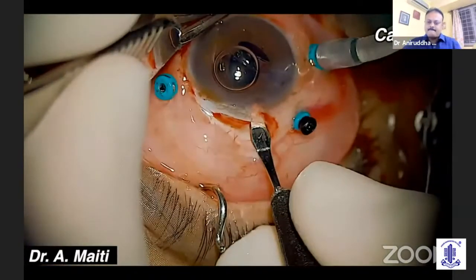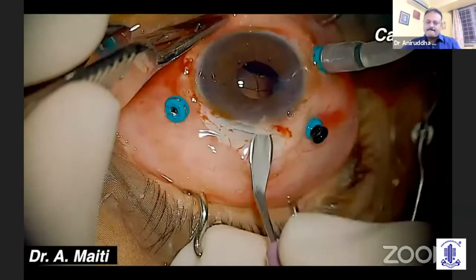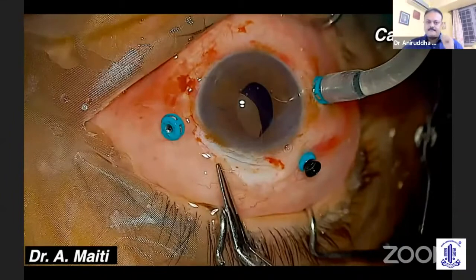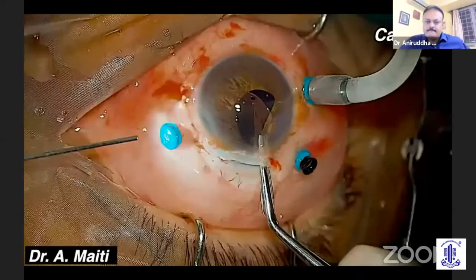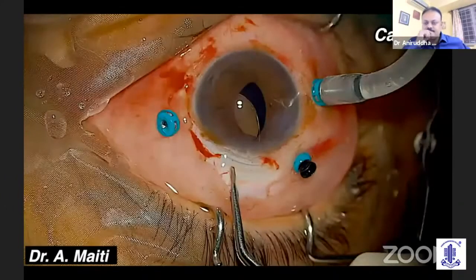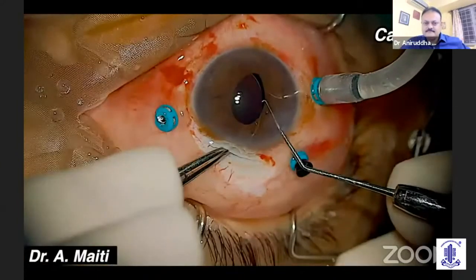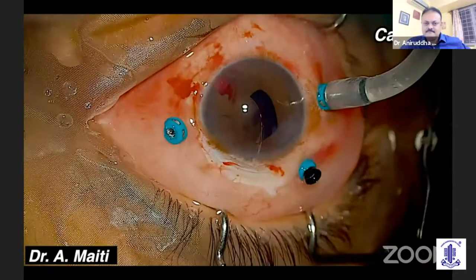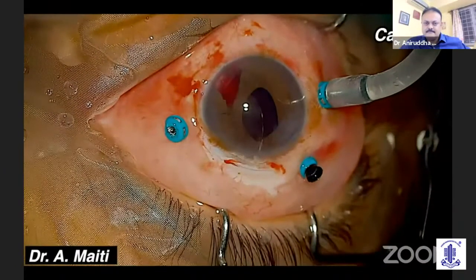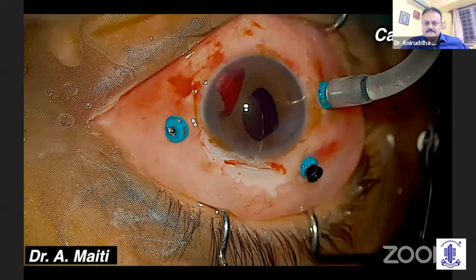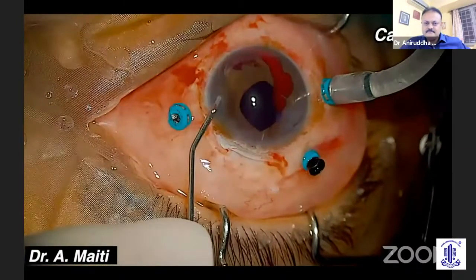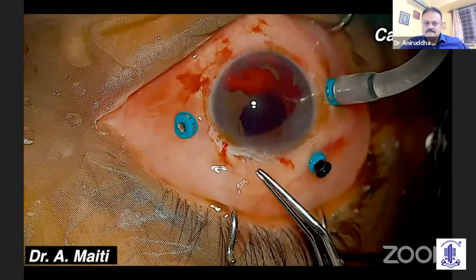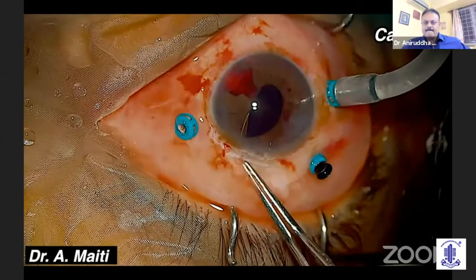After making the main wound, I tried to pull the IOL outside, but the trailing haptic got stuck in the iris. With the Sinskey hook, I tried to dislodge it from the iris, but the haptic caused iris injury and profuse bleeding started. I then pushed viscoelastic and tried to manipulate the stuck IOL from the iris. By this time, the bleeding had trickled down into the vitreous cavity and anterior chamber.